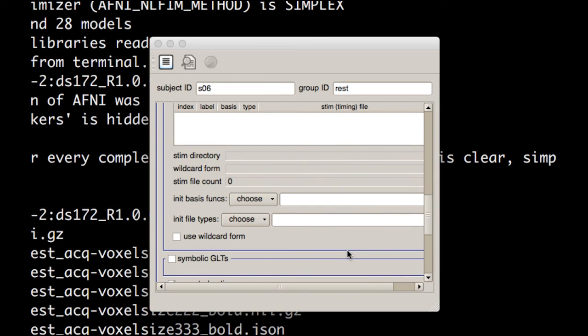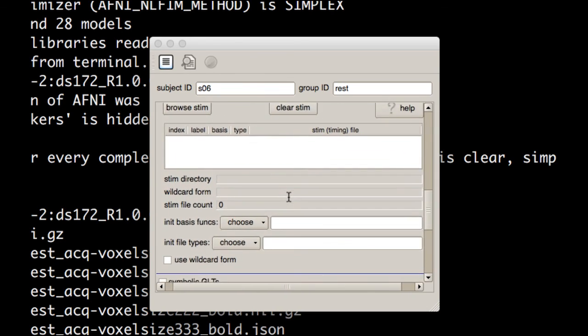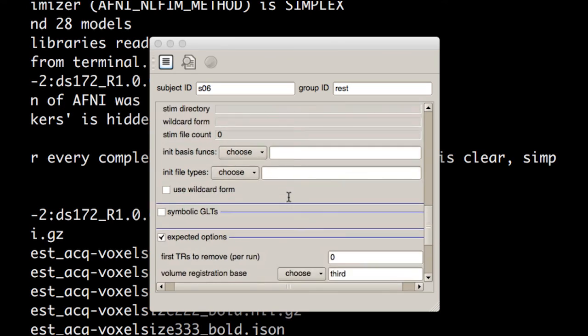Notice that we're not doing a task, so there's no need to mess with anything like stimulus timing, setting up anything with the GLM. We're not going to be doing any of that. We will be setting up a GLM, but it's only to capture nuisance regressors like motion and frequencies that we're not interested in.